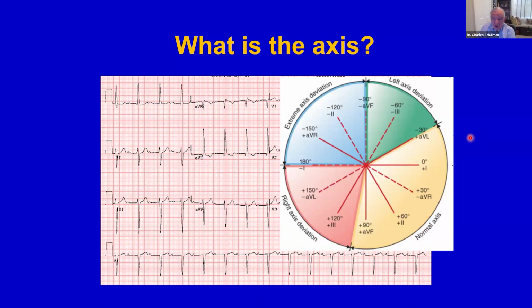Okay, normal, left, or right? Somebody want to put an answer in the chat? Is it normal, left, or right axis? Someone said left. Left axis deviation.